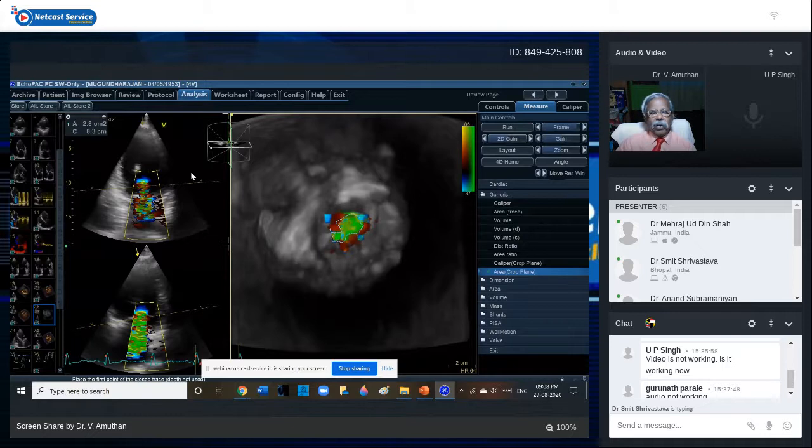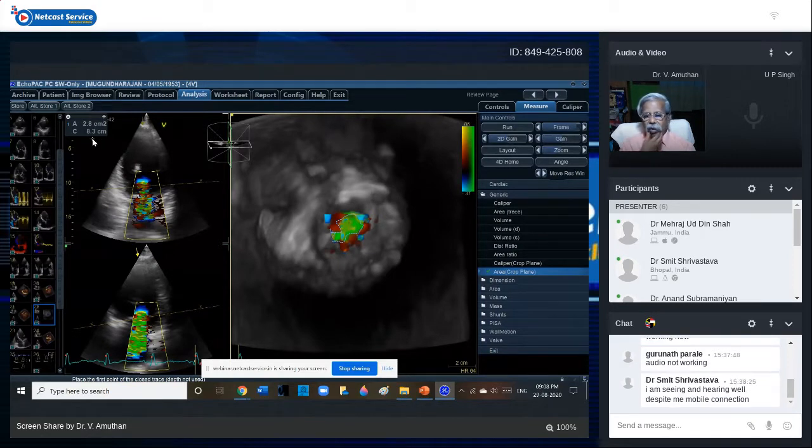And you got that. You see that it is 2.8 cm square. So it's grossly abnormal. I have never seen just this. So we were planning CRTD for this patient, but before that the patient expired.